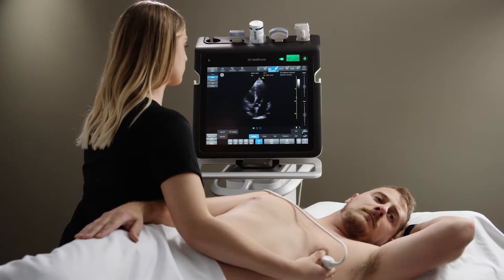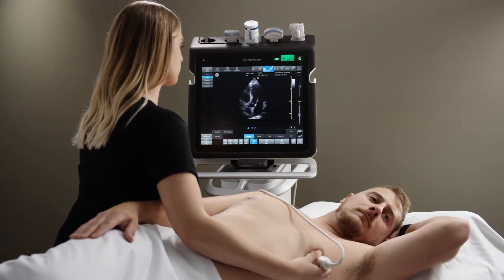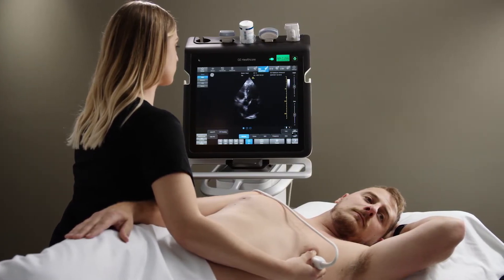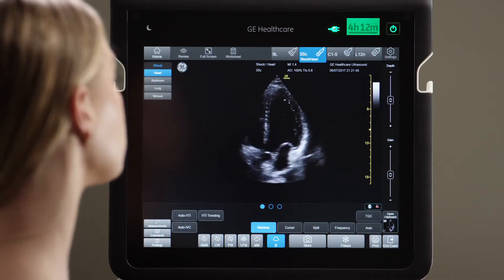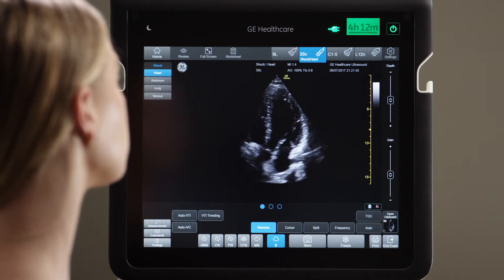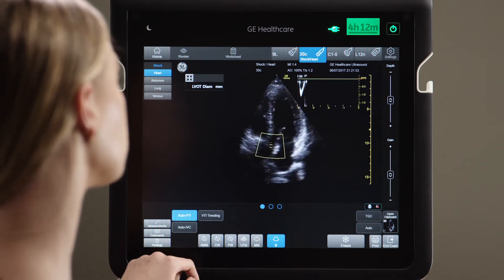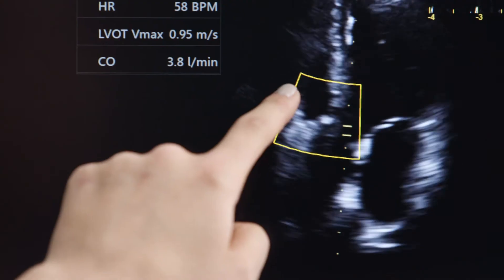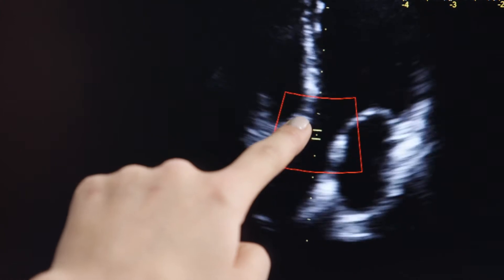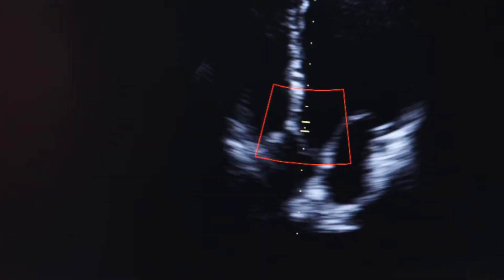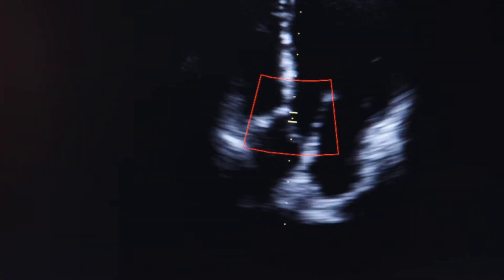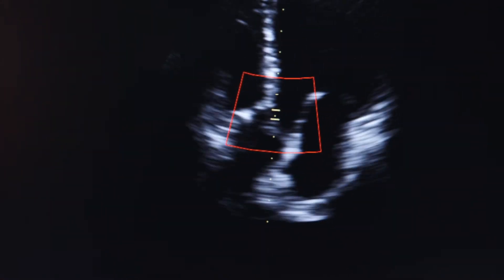When using Venue and you want to assess the VTI, find a 5 or 3-chamber view and press Auto VTI. If needed, optimize the position of the sample box over the left ventricular outflow track.